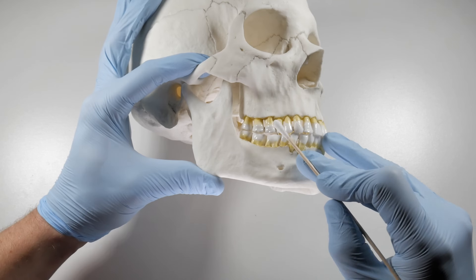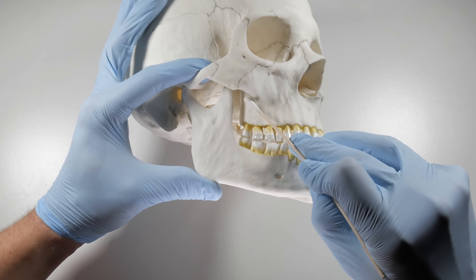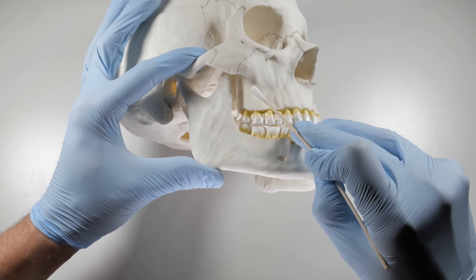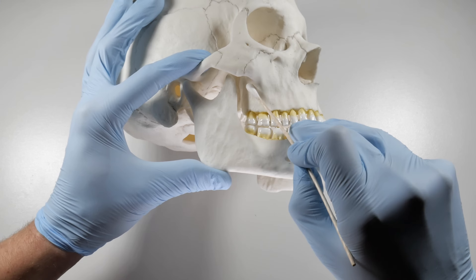Your insertion point is usually over the second molar, and it is right distal to where the zygoma kind of drops in. You're going to push in the height of the vestibule with a cotton swab, start moving distally, pushing superiorly, and you're going to feel this little concavity. That is where you're going to be inserting your needle.